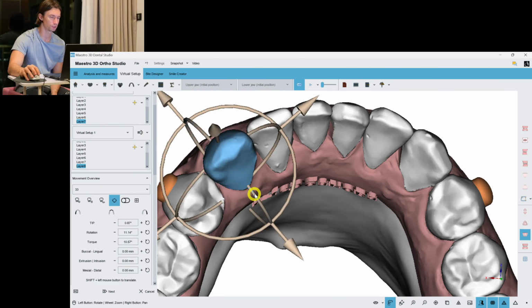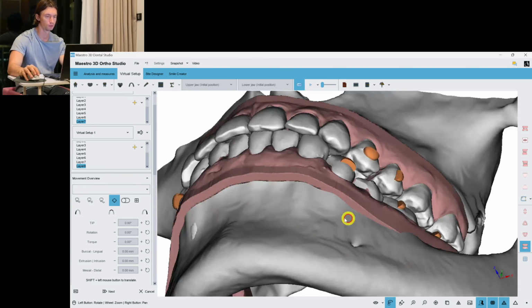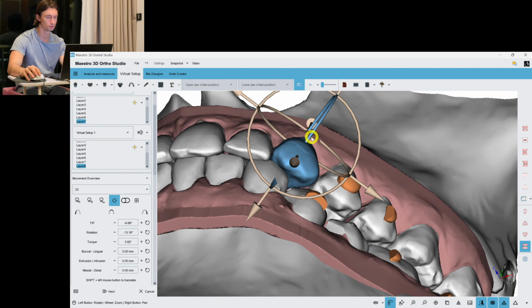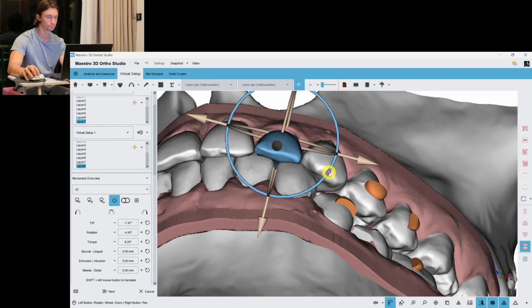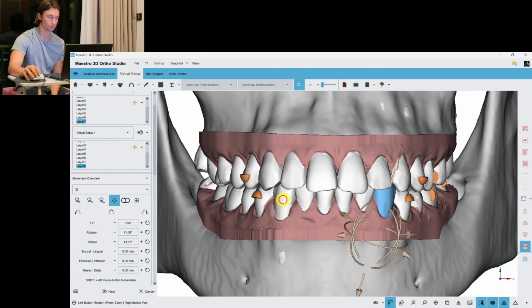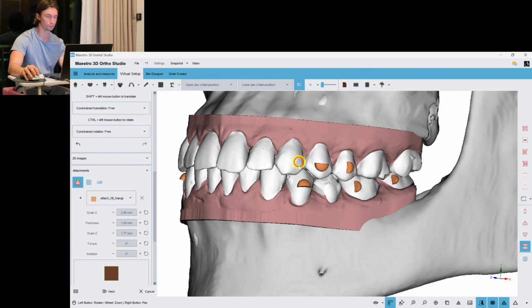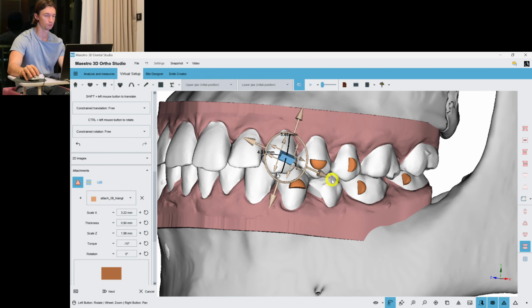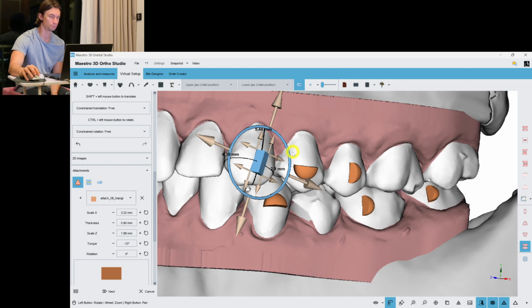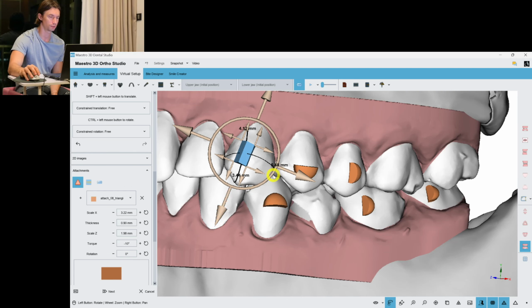I don't like this position of the canine. Let's maybe leave it a bit farther. We also need attachments on the canines, which we rotate. So that we need 3 attachments for rotations of the canines. And I prefer to use these triangles. I saw some doctors on Instagram use them, and I started to try these attachments. I like the results, and that's why I use them very widely.